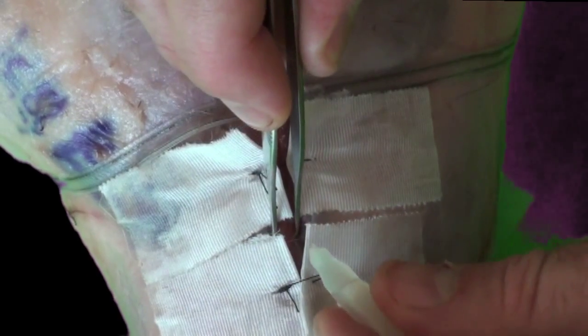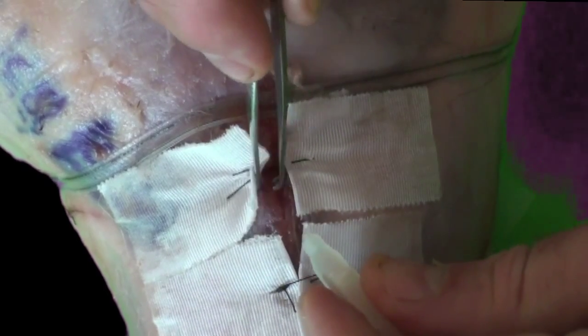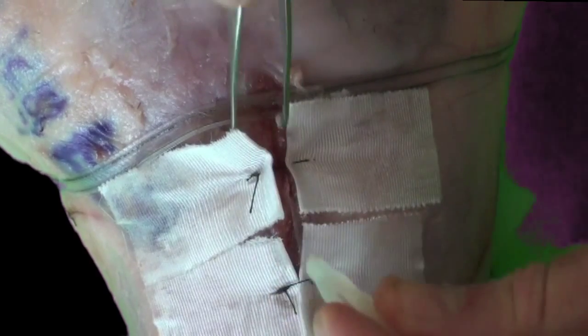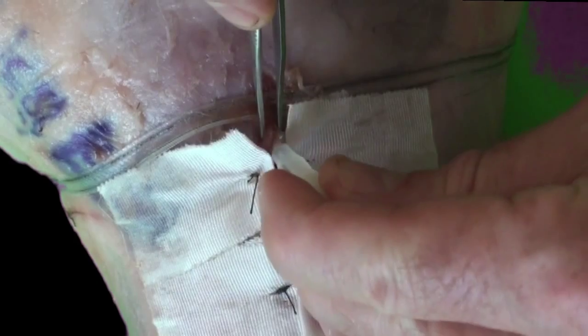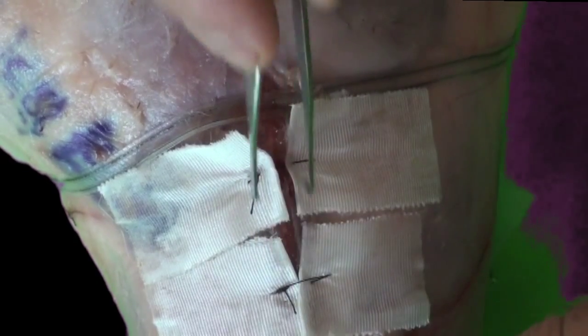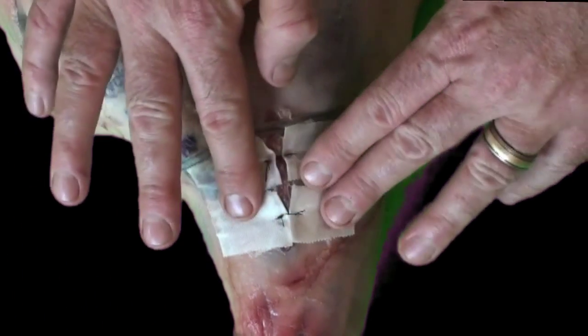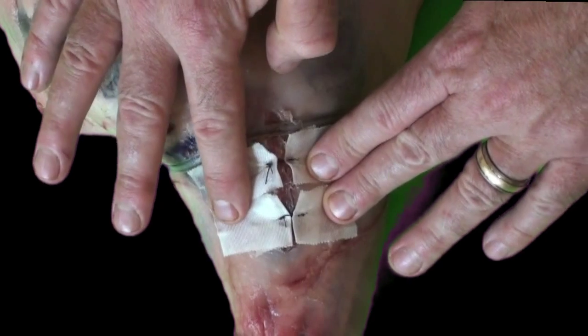The final step is to use your tissue pickups and apply a little bit more adhesive — whether it's Dermabond, Indermil, or some other substance — along the superficial wound margins. Again, no needles are used and you just want to give it a little bit of extra support right there. There should be no tension on that wound, and as you can see I give it a good tug and the wound is nicely brought together.